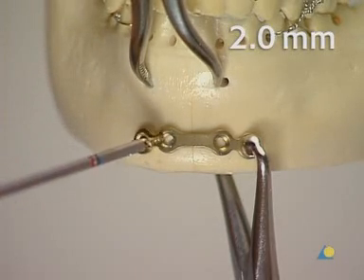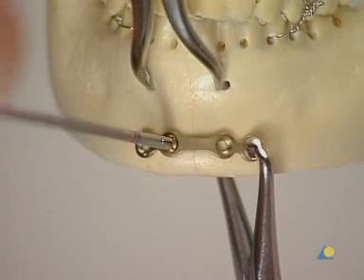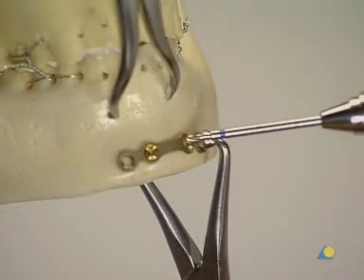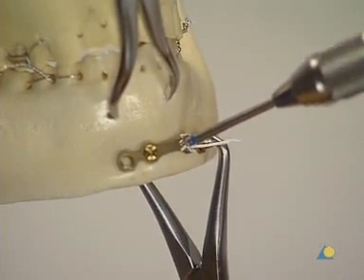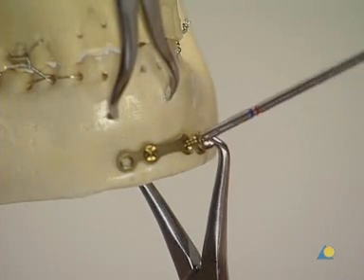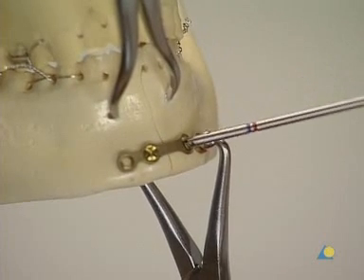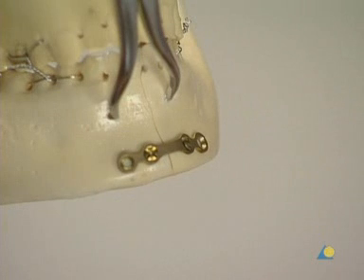A 2 mm screw, 6 mm in length, is inserted. It is not fully tightened until the final reduction and plate position are confirmed. A second screw is inserted on the other side of the fracture in the same way. Both screws are then tightened. The forceps is removed and the remaining plate holes are filled.